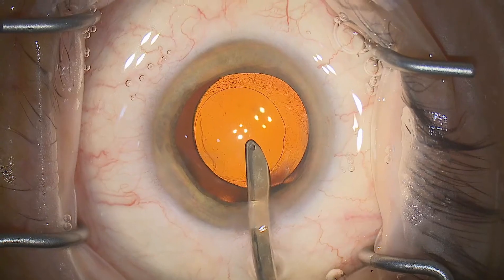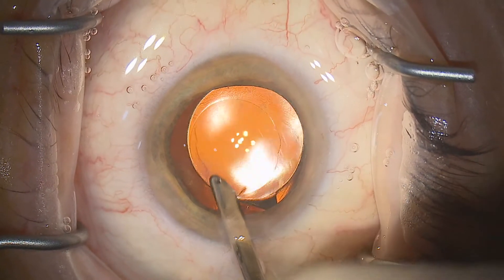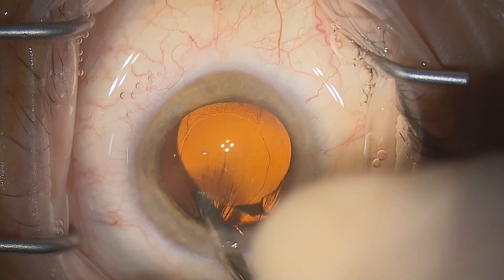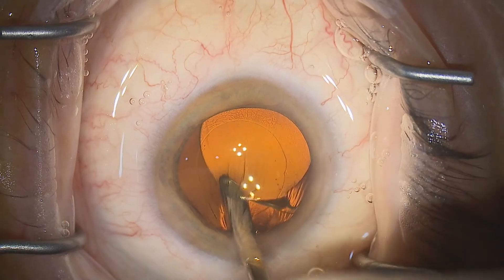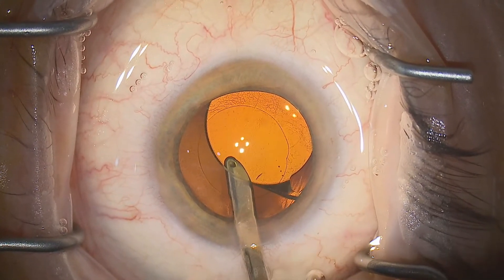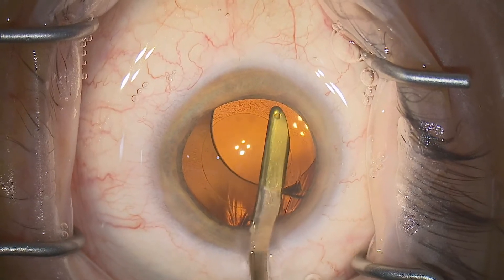Also have a think about the IA system you're using. One of the reasons I like the Simcoe — it's a little old-fashioned perhaps — but it has direct coaxial irrigation, which makes this step here, which we're seeing in slow motion of nudging under the optic, very safe indeed because you're always blowing in front of you with the irrigation.